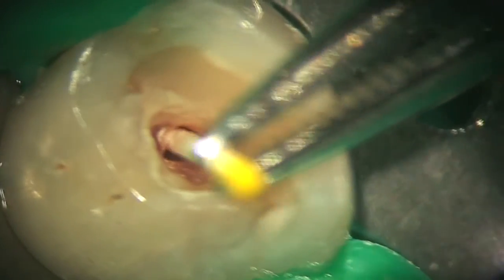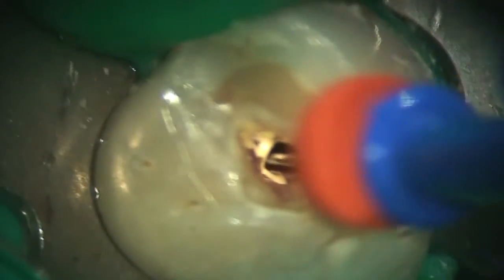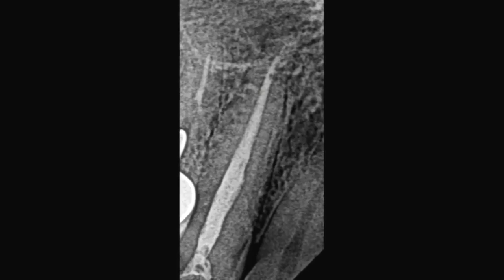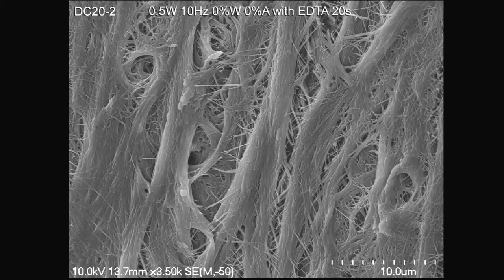Usually when the fluid is placed inside and the first activation of PIPS occurs, there's quite a bit of clouding. Then after about 20 seconds, we place another new volume of fluid in, PIPS it again, and that clouding gets less and less — usually between the third and the fourth cycle. We wait for it to be clear, and then we pretty much assume that's as clean as we're going to get it. We do about three to four cycles, most cases three — and anything more than 20 seconds per interval is not necessary. Take a look at all the anastomosis in all the lateral canals — there are hundreds of little lateral canals, like little electrical pulses traveling outside the end of that root. That was in the apex.